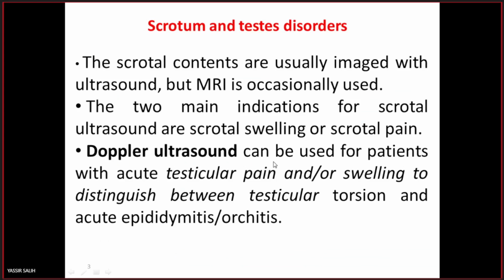When we are going to assess the scrotum and its content, ultrasound is the most common imaging modality performed for assessment of the scrotum and its content, for assessment of the testis and the epididymis.